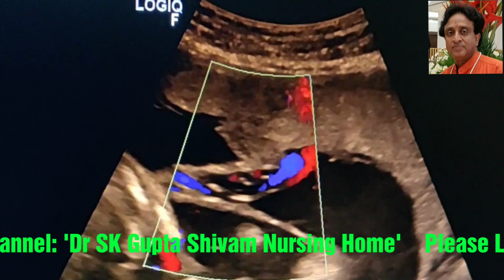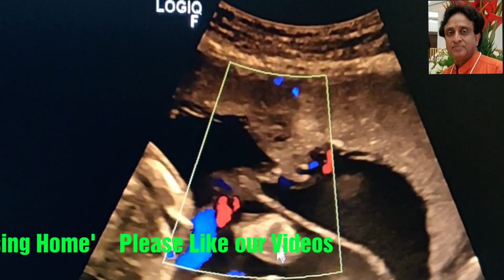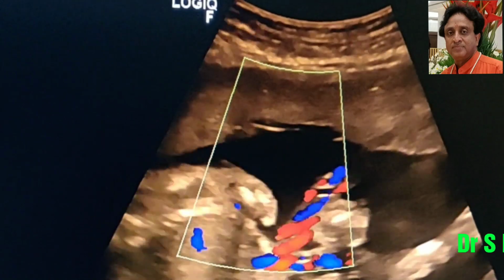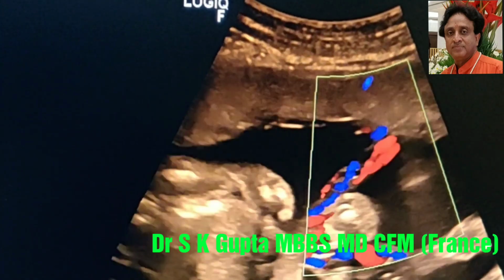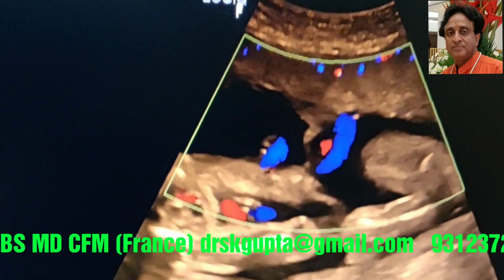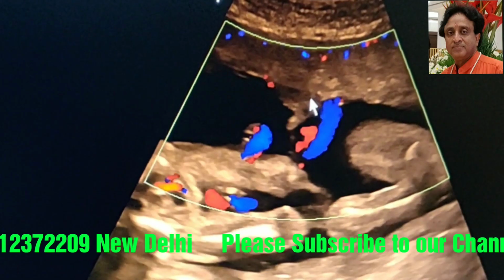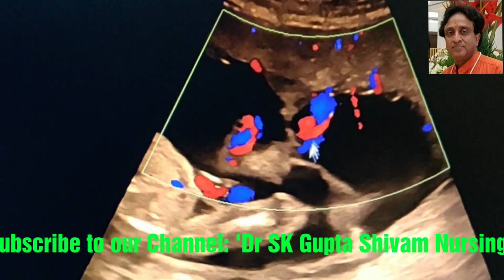When we try to put in the color, we find that there are two umbilical cords. This is the umbilical cord of one twin, and when we try to see both the umbilical cords, we find that both are visible separately. Let us see their attachment to the placenta, and you can see both the umbilical cords attached to the placenta near the center, and this is at the origin of the interamniotic membrane.